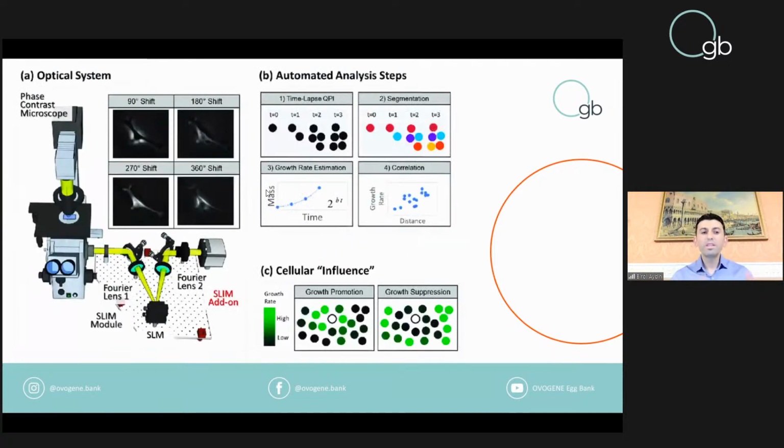So this is how we implemented it to the microscope, because most artificial intelligence systems work image-based. You put the embryo in the time-lapse incubator, the time-lapse incubator creates high-resolution images and video, and then the artificial intelligence software tries to analyze and give different possibilities.